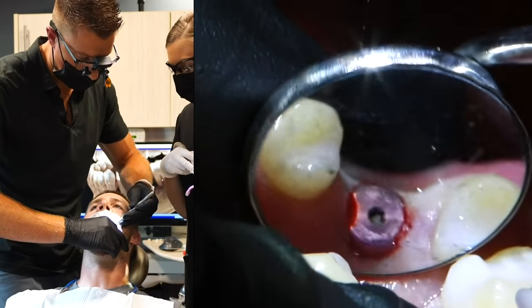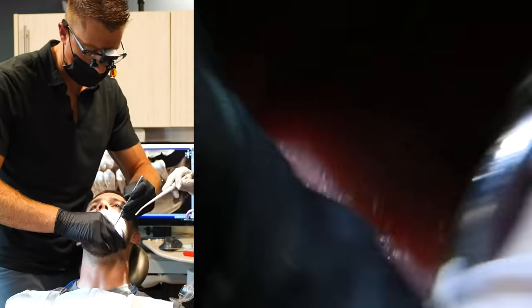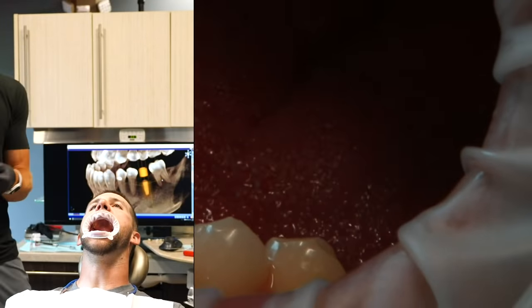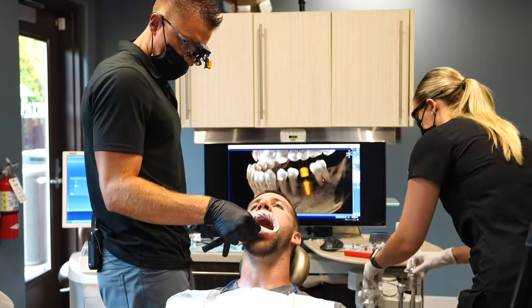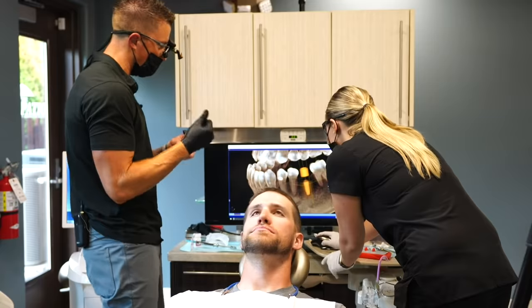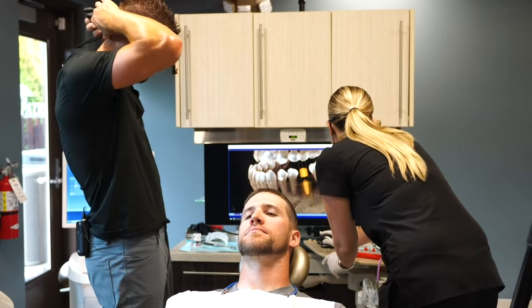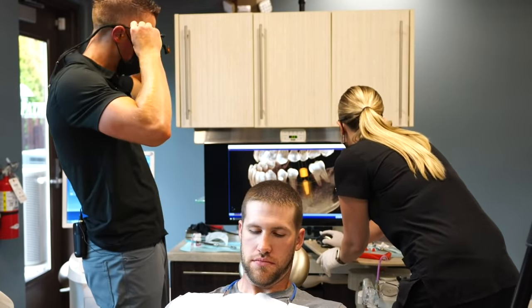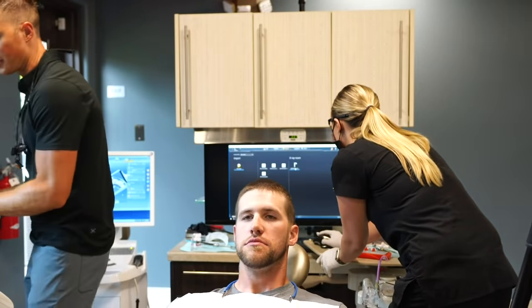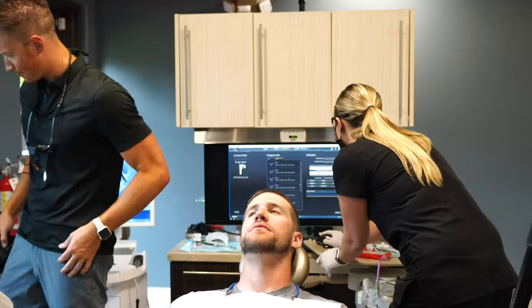And I was going to have Des go ahead and get another 3D so we can verify position, just to show kind of where we ended up. So we're getting one more image here, Trey, and show a before and after of our placement of the implant. What other questions? Do we have anything there, Michael, during the placement of the implant people come up with?